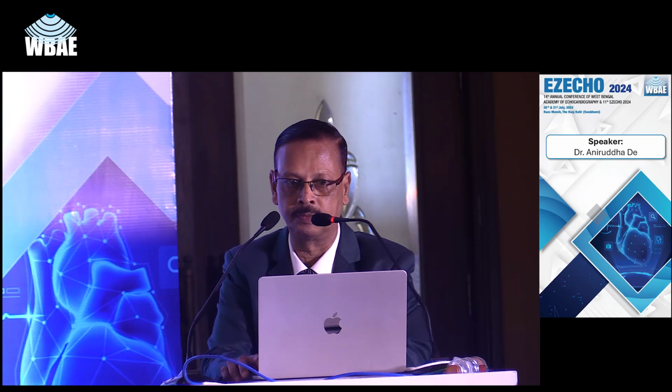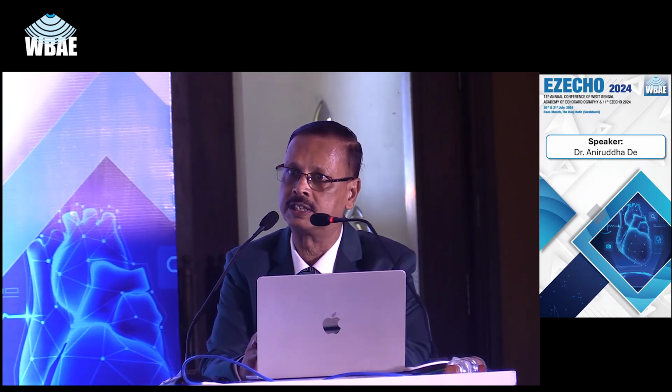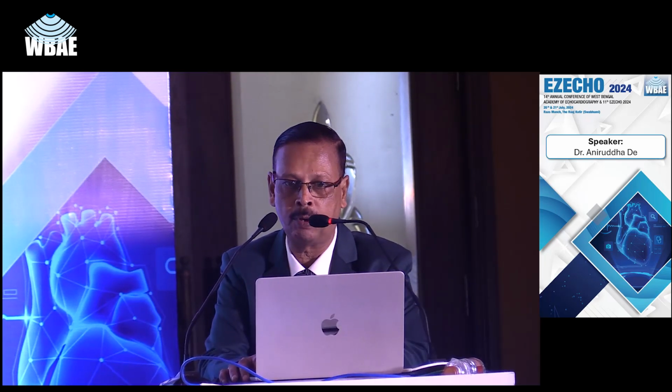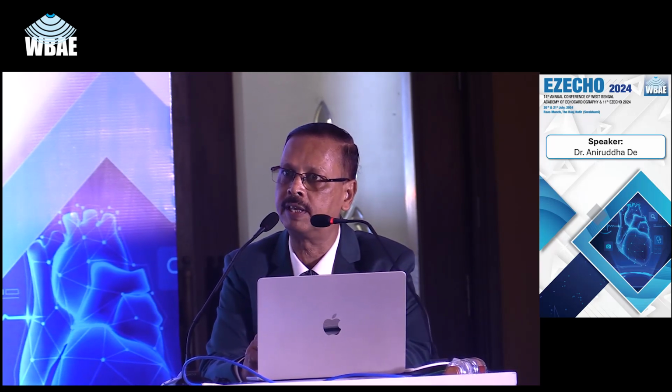Diastolic function evaluation in atrial fibrillation. So we know everything in this chart about the diagnosis of diastolic dysfunction in normal sinus rhythm, and I'm not going to talk about this. The most important thing in atrial fibrillation is the absence of the A wave.